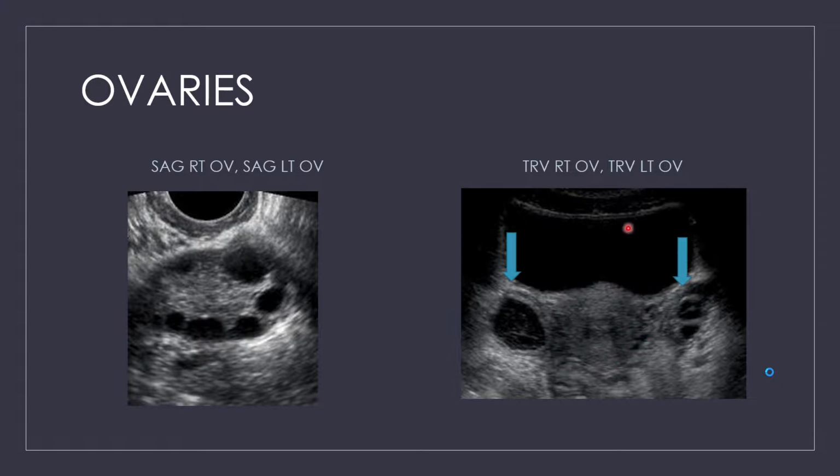This is the bladder. It's a full bladder, and we may even be closer to the cervical area, because this is kind of that catfish whisker look. See, there's a dark line, but this is the endometrium. So you're getting some shadowing from the side there. But this is the right ovary, and this is the left ovary.